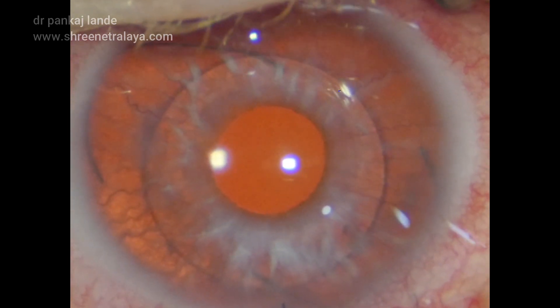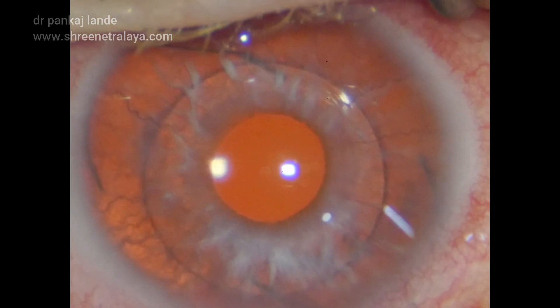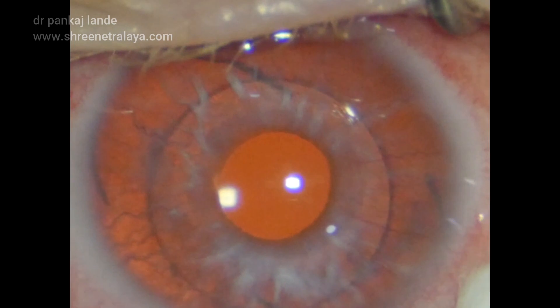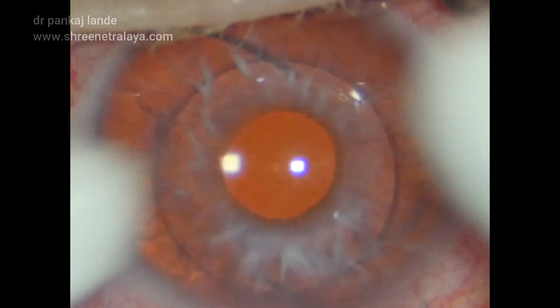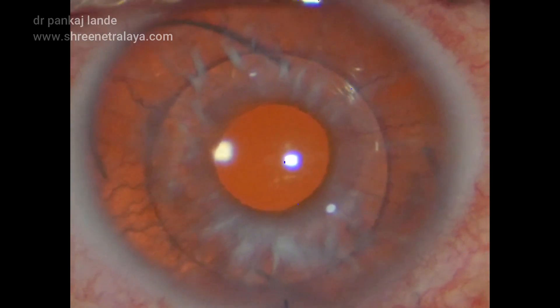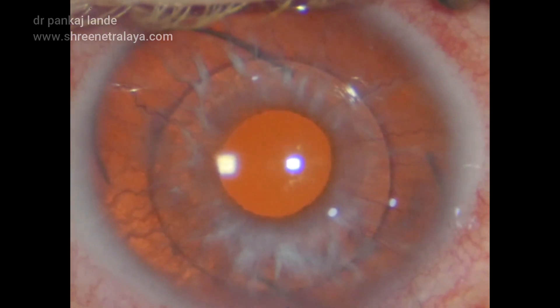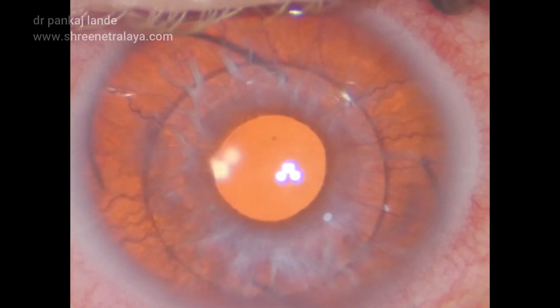As planned, we have proceeded with tattooing of this cornea in a circular fashion, leaving a central island of clear cornea as it is. I am going to do this in a phased manner, one quadrant at a time.